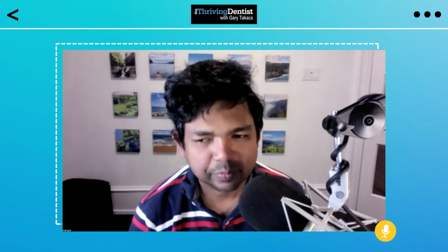You all know, if you're a regular listener to the podcast, that I'm very much in favor of taking a series of 6 digital photos of our new patients for patient education. And the simple reason is we all know that saying, a picture is worth 1,000 words. So you can talk all you want, or you could show them pictures and they're going to get a lot more out of the pictures. So I think it's really important to take 6 digital photos for patient education for all of our new patients.